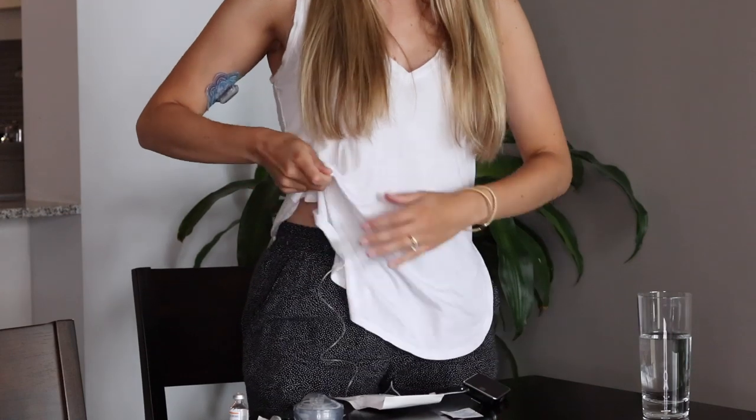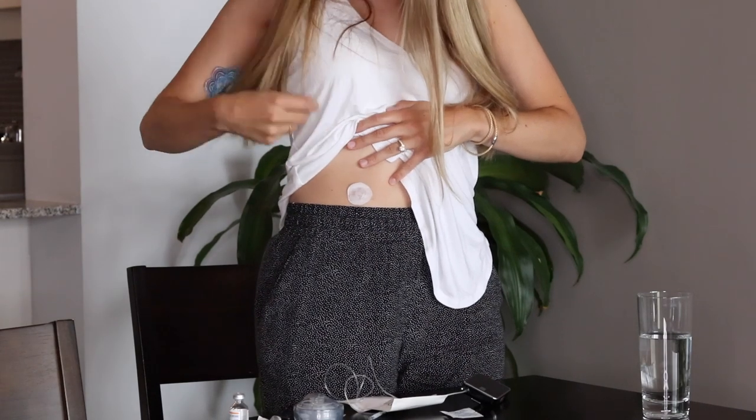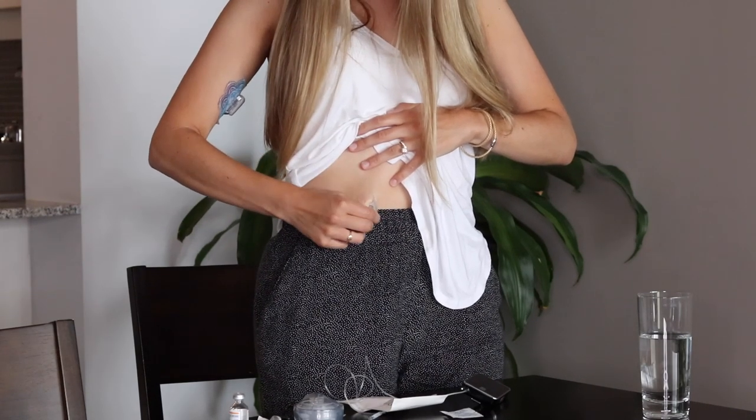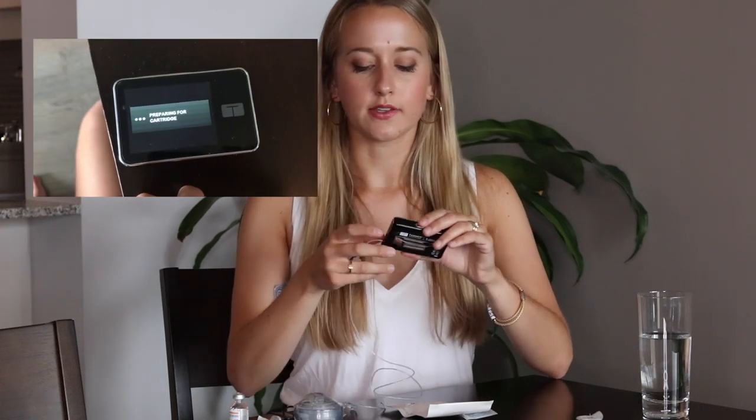First, I'm going to take out my old site and disconnect so I'm completely disconnected during this process. I don't want to accidentally deliver any insulin — that would be a disaster. My site is in my stomach, so I disconnect and remove it. Then in the pump I go to Options, click the down arrow, and select Load, then Change Cartridge. It tells me all insulin deliveries will be stopped, and to make sure the infusion set is disconnected from my body before continuing.